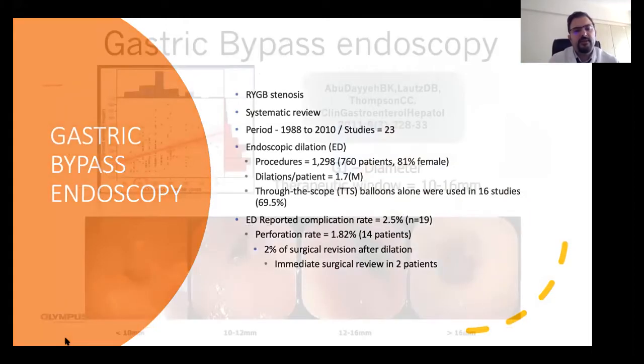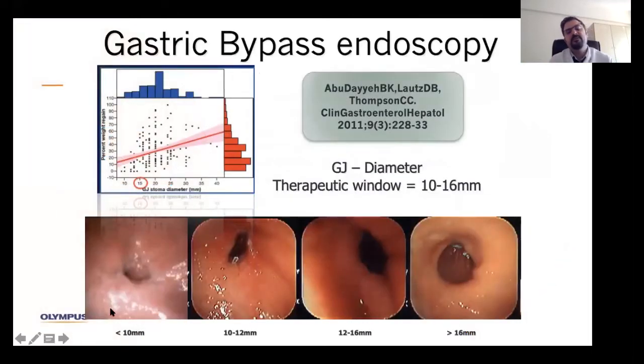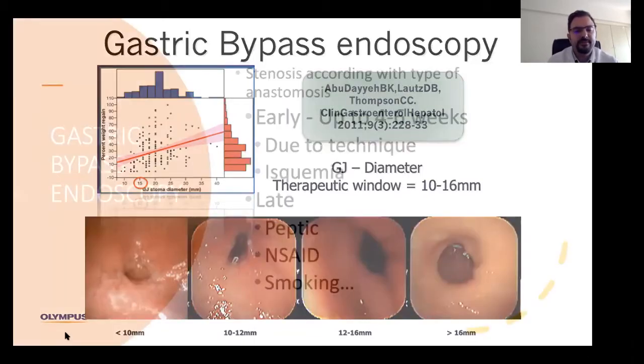I will just show you some pictures, not too much. These are too much advanced techniques, but when you have an anastomosis in bariatric, in oncologic surgery, if the patient comes with you vomiting or not feeding enough and losing weight, it can be because of an anastomotic stricture. So by using an endoscopy, it's easy to see these strictures and to dilate them by using an endoscopy. So if they are lower than 1.5 centimeters, and the endoscope cannot go through this anastomosis, then you have to dilate this, and you don't have to operate the patient again.